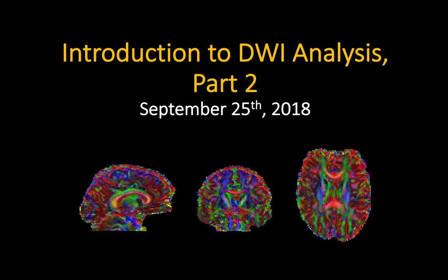So if some of these things seem a little bit over your head, I will try to give you enough background to follow along. But be aware that this is part 2 in probably a 3-part series on diffusion-weighted imaging analysis. So I'm already assuming that there's some background and some technical skills are known. That being said, feel free, if you have any questions about what I'm discussing, please ask.